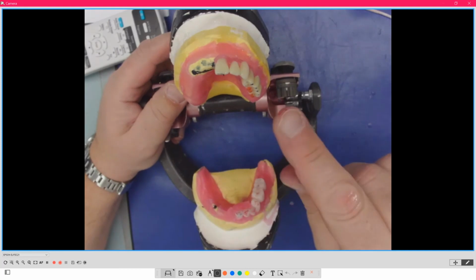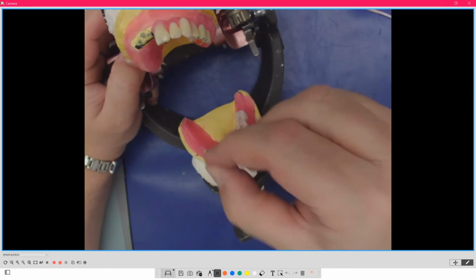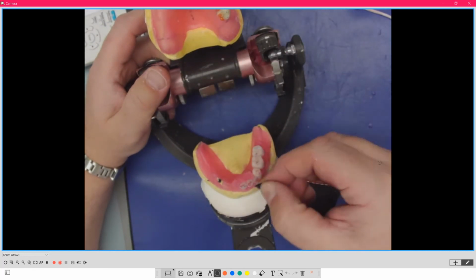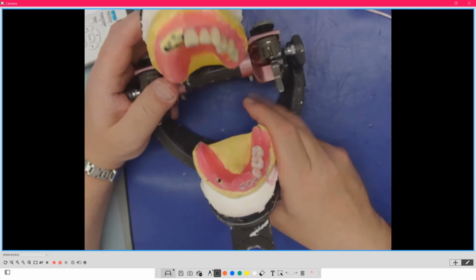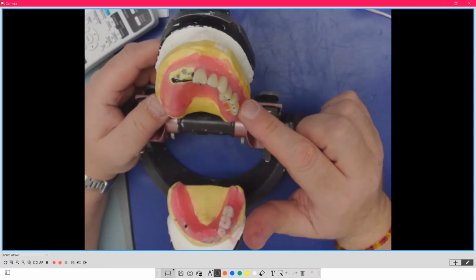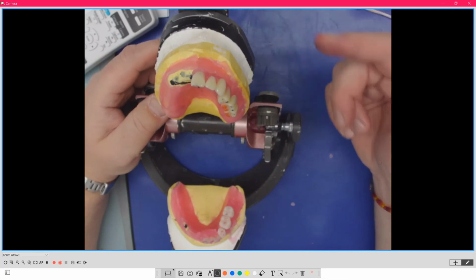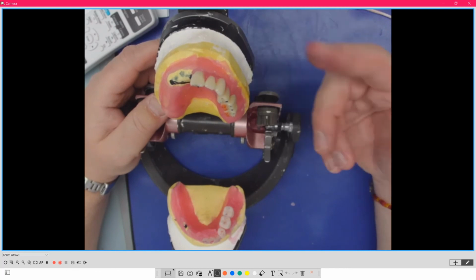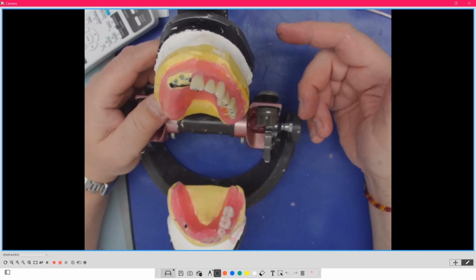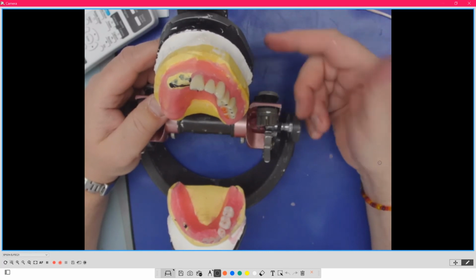Now I can't take the dentures out, but I would get in there clinically, dry everything off, and mark everything like I just did with the Q-tip. I can at least do the front, and I can take the Q-tip and do the posterior, and then get the patient to function for me with an all on 4 or all on 6, and find those little hits and slides. Again, I have to get the light in there and a mirror, and they can be difficult to see, but I'm looking for the width of a human hair. Then I can adjust that intraorally without having to take the whole case off, which is a huge time saver for me. These are little tips that I can give you to help reduce your stress load and help reduce your burnout load.